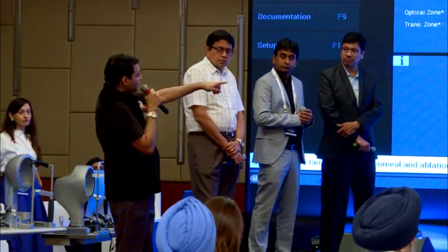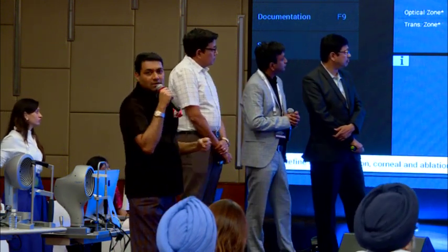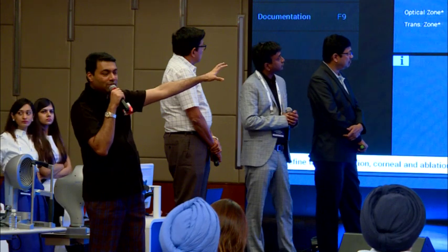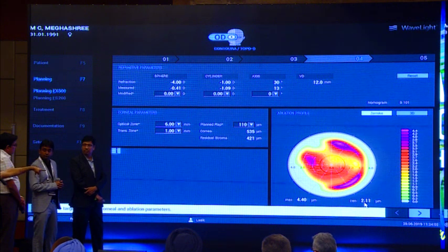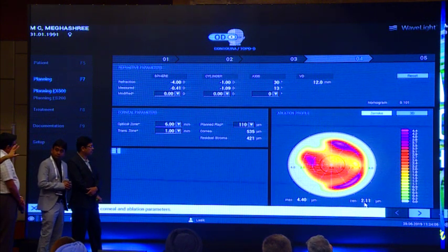One of the interesting things here is when you don't match, like I said, CONTOURA is not a no-brainer procedure. You need to spend some time when you have these kinds of problems, because one of the most important rules here is that when you keep it 0, then you get the right picture whether CONTOURA is working in this patient or not. And Dr. Ramurthy sir showed very nicely, even though the values are small, there's still a lot of coma being treated. So when you see that a lot of coma is treated, that means that coma is there in this patient.